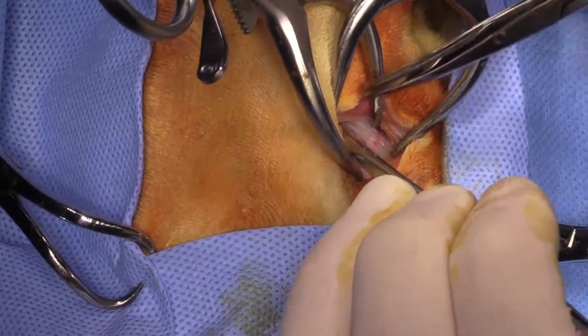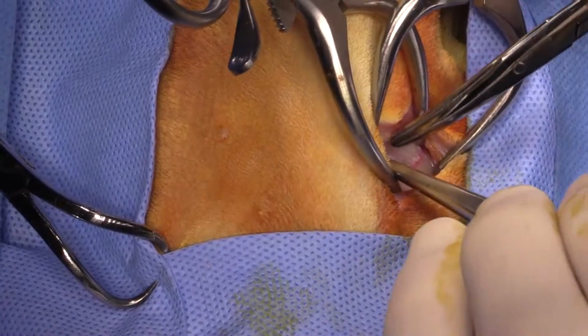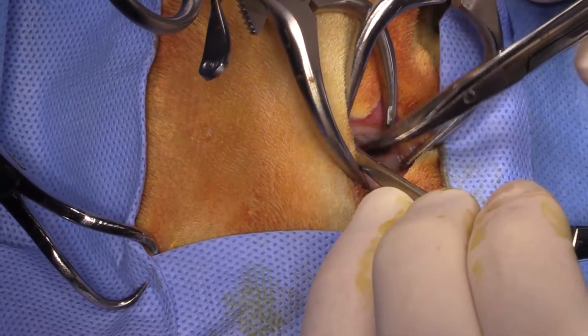So there's the facial artery sitting right there, right in the middle of my incision. And your view might be better on the opposite side.